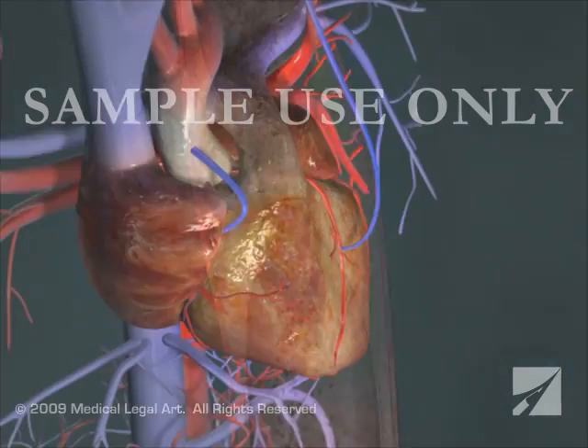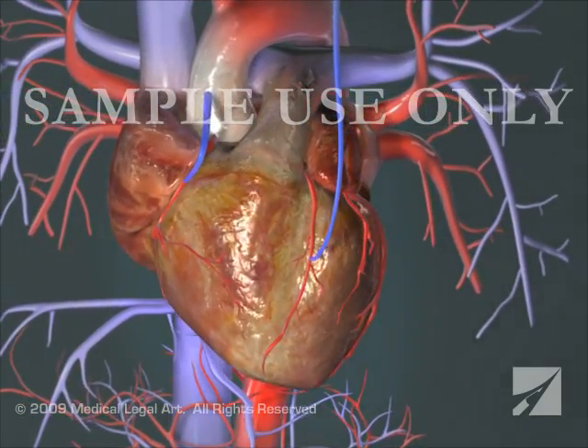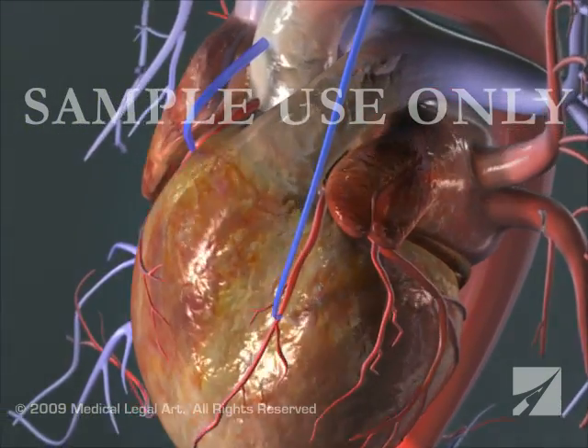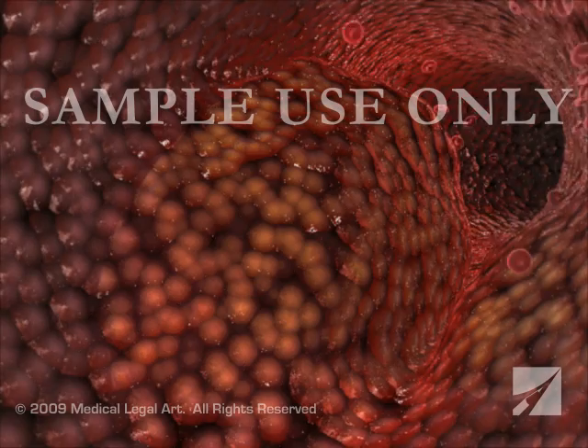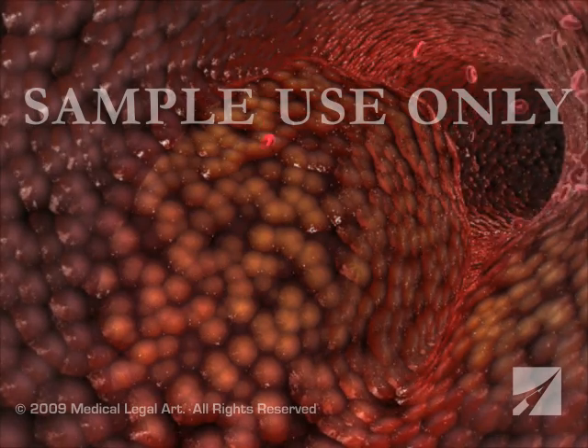In this procedure, a healthy artery or vein from another part of the body is connected or grafted to the blocked coronary artery. The grafted artery or vein bypasses the blocked portion of the coronary artery, carrying oxygen-rich blood to the heart muscle.